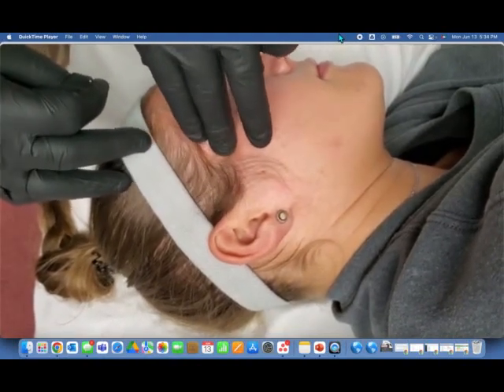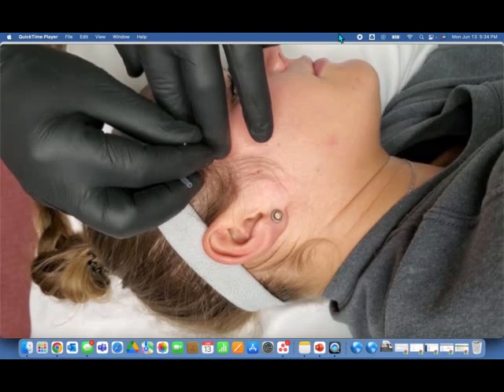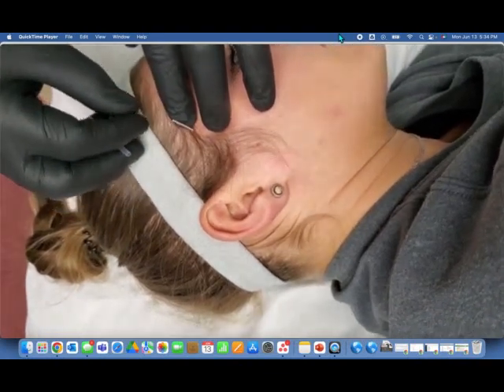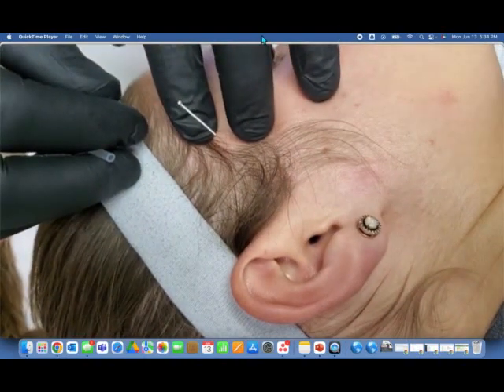Again, this location is where the muscle is a little bit more prominent, a little more bulky, if you will, and we seem to get a little bit more response out of that when we apply stim in this area. Can be deeper, so I did go with a 3 centimeter needle here.